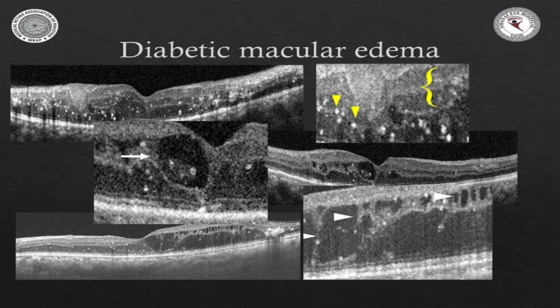So आपका न्यूरो रेटिनल टिश्यू है ना, so उसमें सारे जो बात है वो सब ये है कि लाइट को रिसीव करना है और इम्पल्सेस देने हैं, and for that there are a number of cells that play within these 9 layers that are interconnected and you have neuronal pathways. So atrophy of the septa structurally translate to loss of neuronal receptors, and therefore again a bad prognostic sign.